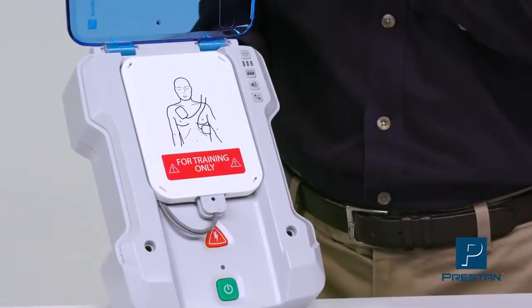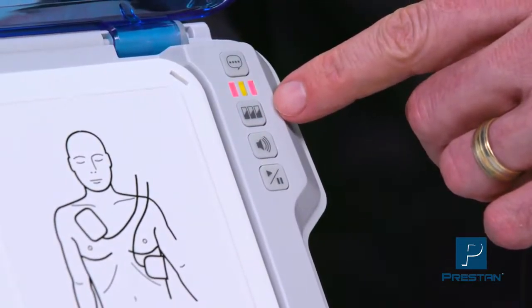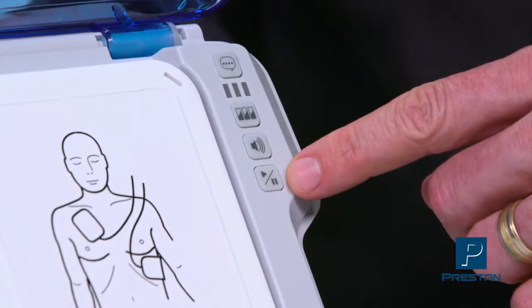The control panel allows for selection of two languages, five scenarios, and three volume settings. A pause button allows you to capture those teachable moments at any time.